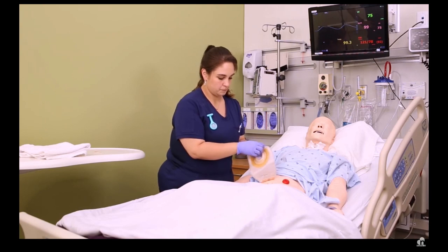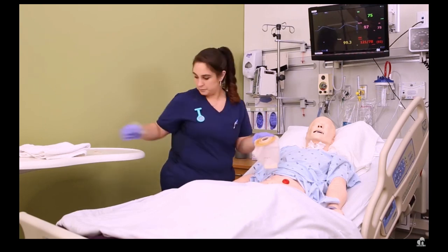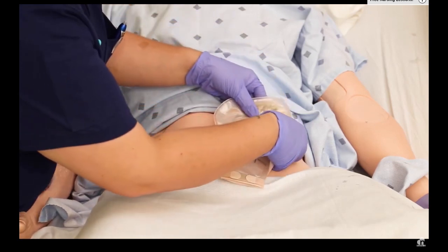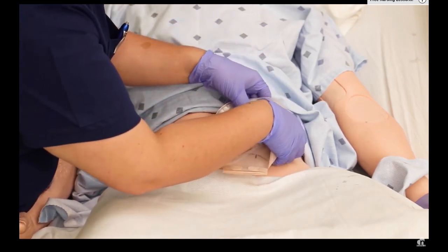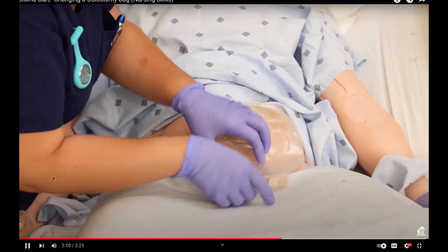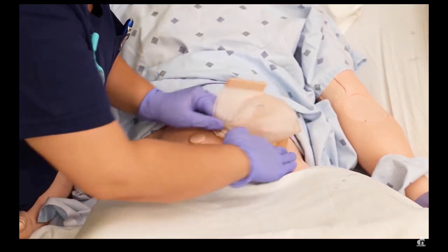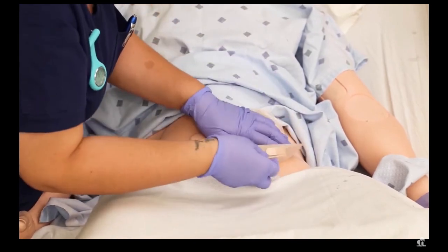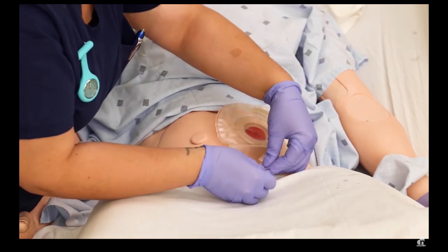If you need to, apply skin prep or barrier to the skin around the stoma, and then remove the backing from the wafer and apply it to the skin with the stoma in the center of the hole. Now, for patients who've had a stoma for a long time, they may have a preference here of which angle they would like their bag going. Some of them like it going straight down, some of them like it going off to the side. So just make sure you talk to your patient about that.